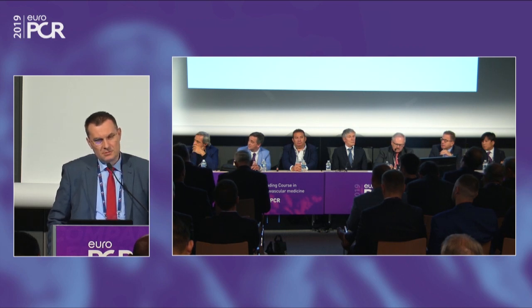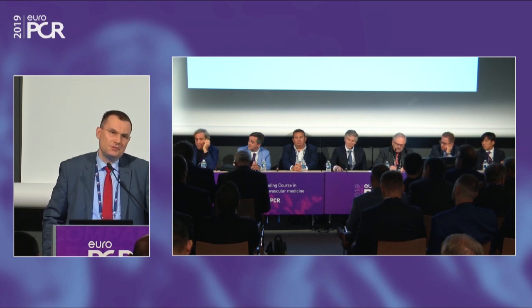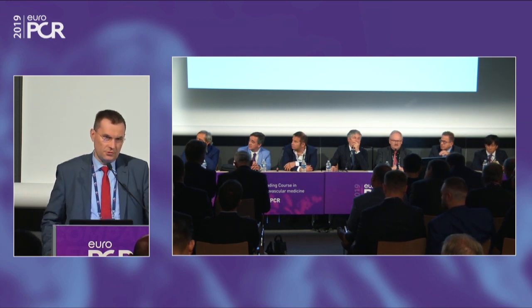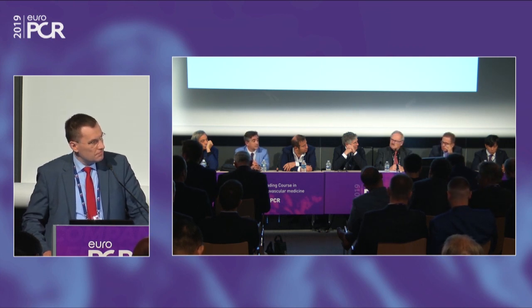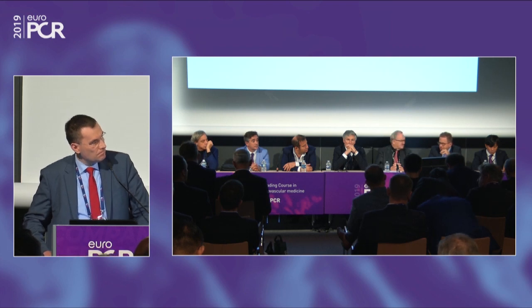Because if you have a 2.5 side branch with a 3.5 or 4.0 proximal size of the bifurcation, it is very difficult in reality to expand this stent in the proximal section. So your question probably was associated with the danger of decreasing the lumen in the orifice of the side branch. My suggestion is rather to avoid 90 degrees. Much better is up to 70.